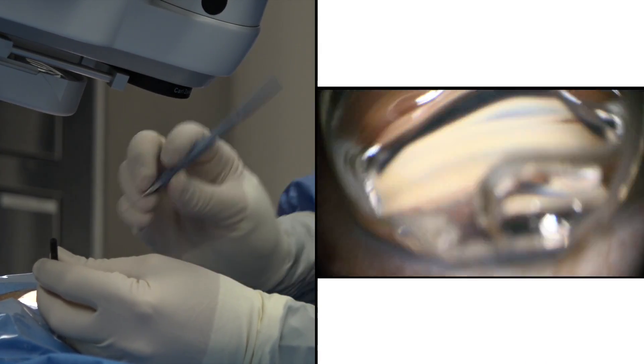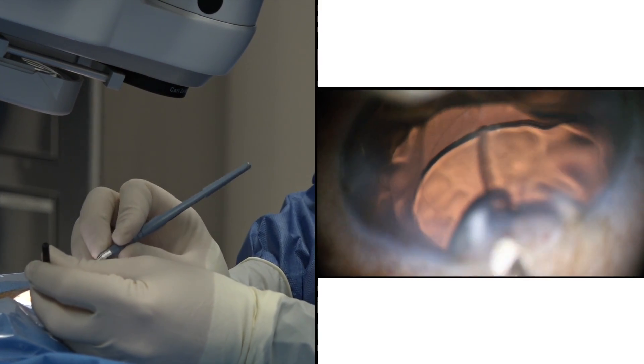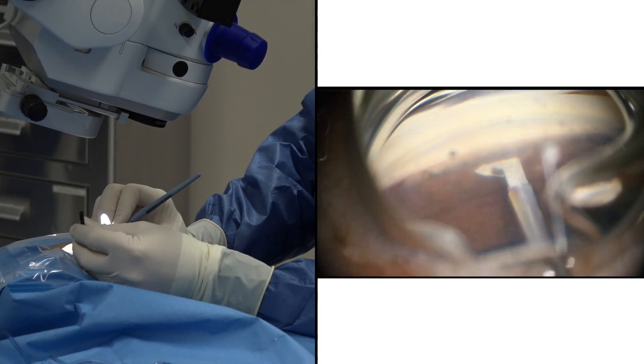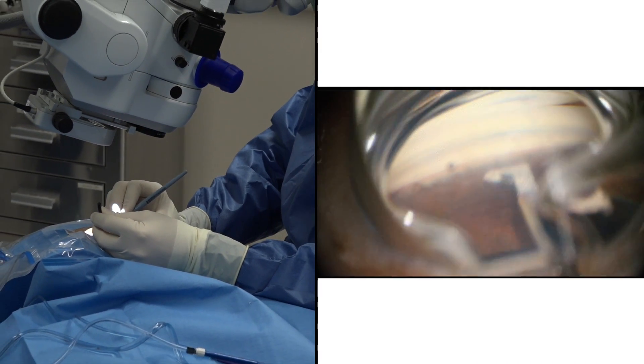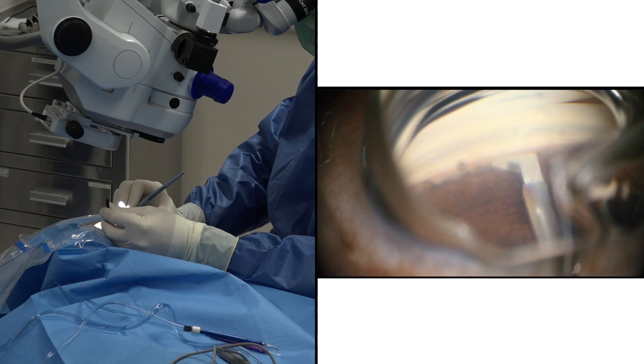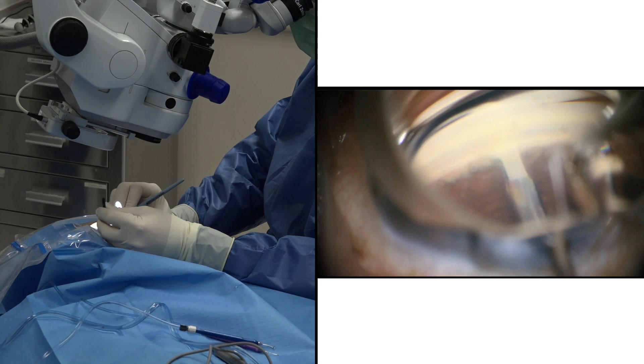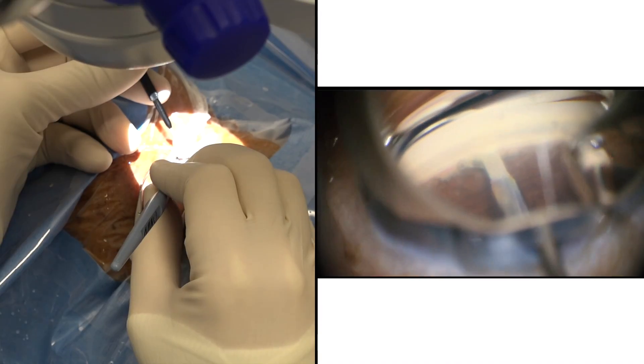The dual blade has a tip that can comfortably pierce into the canal through the trabecular meshwork. The two blades have a ramp — the ramp puts tension on the outer wall of the canal and the trabecular meshwork, and it removes a strip of trabecular meshwork as you move along.